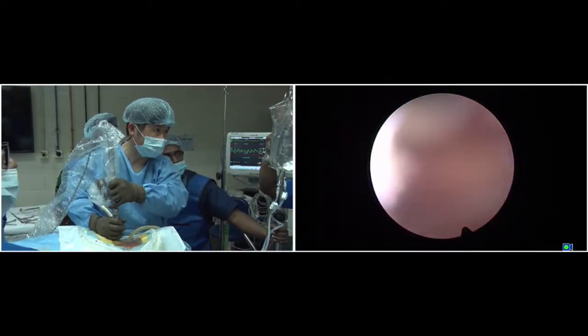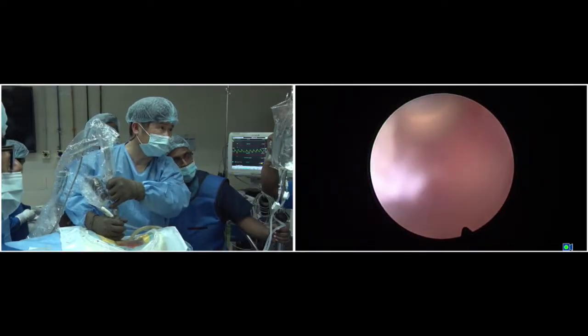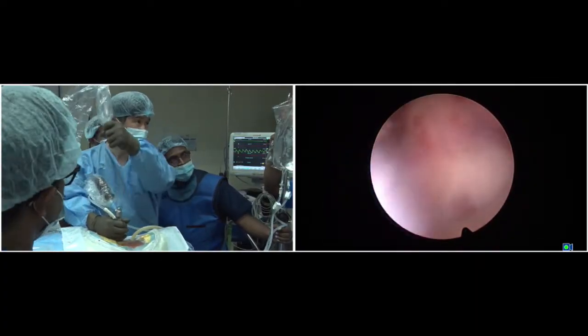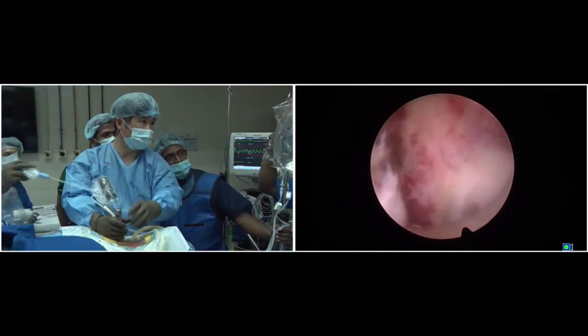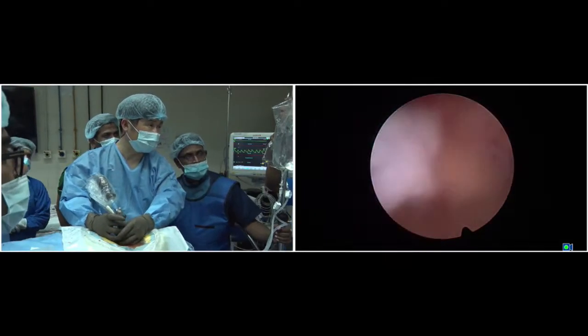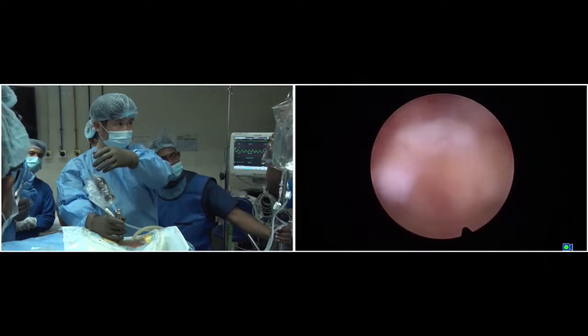Sorry, now the drill is so weak, and the bone is very strong. Yeah, here is a V point, inner V point here. Forceps. Forceps.